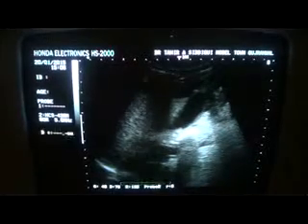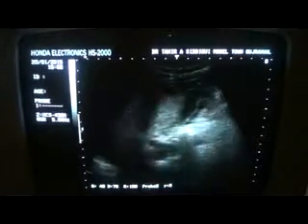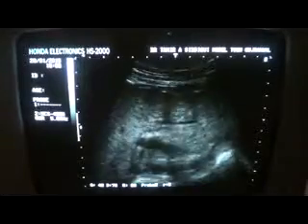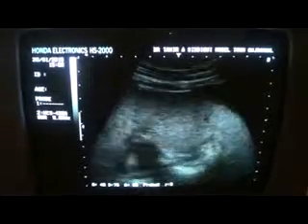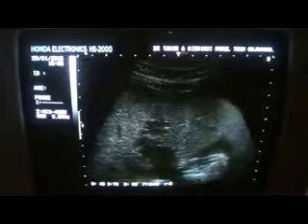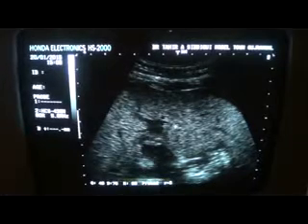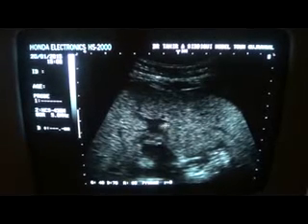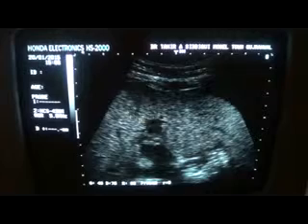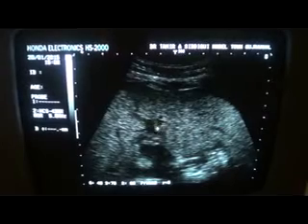Gallbladder is normal. No calculi. The portal vein is of normal caliber and is patent. Now this is the left lobe of the liver in transverse section. No evidence of intrahepatic bile duct ectasia, and this is the ascending part of the left portal vein in view, with branches entering into it. This is the left horizontal branch anterior, and this is the ascending part of the left portal vein. This is the left horizontal branch. Right horizontal branch entering the portal vein.